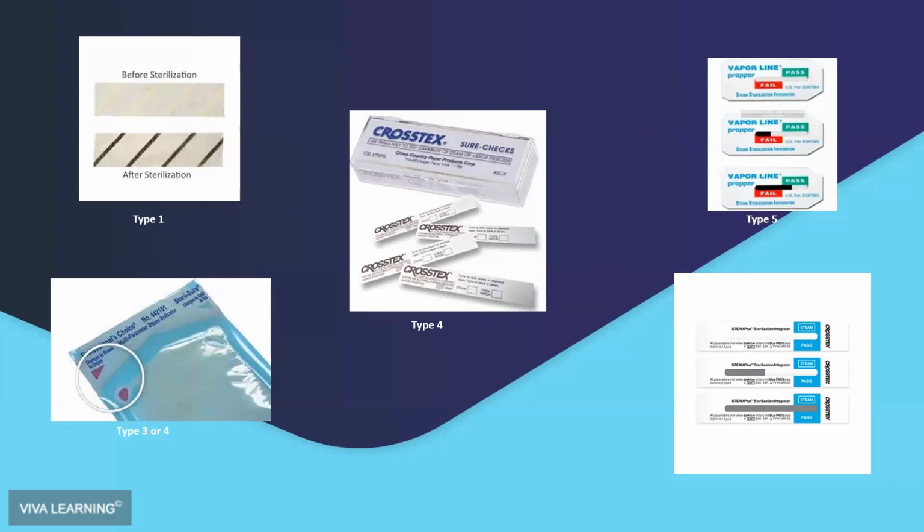Those are appropriate for items that are used in the mouth, that touch mucous membranes, that need to be decontaminated after use. Simply spraying them with a surface disinfectant, which is not as broad spectrum as a high-level disinfectant, is not acceptable. But the items have to be able to be immersed.